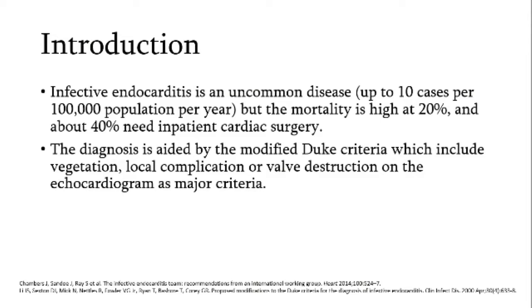The diagnosis is aided by the modified Duke criteria, which include vegetation, local complication, or valve destruction on the echocardiography as a major criterion. So our talk today will target echocardiography as one of the diagnostic tests for patients with infective endocarditis or suspected infective endocarditis.